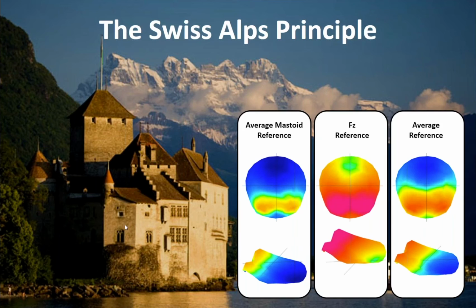Dietrich Lehmann was very good at describing this to people. If you were a geographer making a topographic map of the Alps, the shape of that mountain, how hard it would be to walk up to the top of a mountain, wouldn't change depending on where you drew sea level. So the steepness and flatness, the topography, is reference independent.